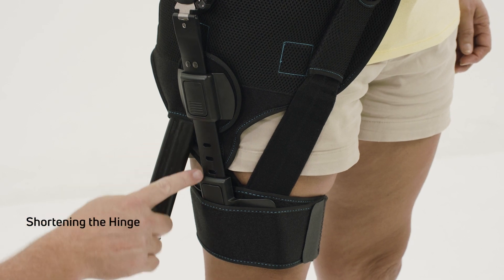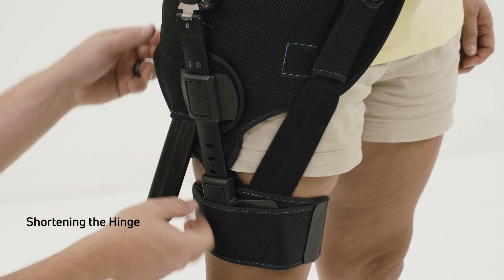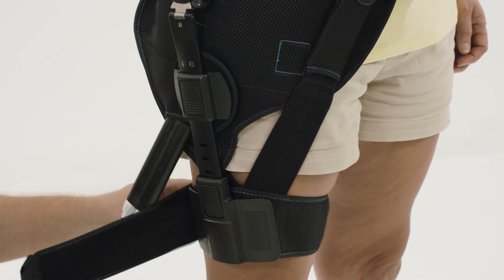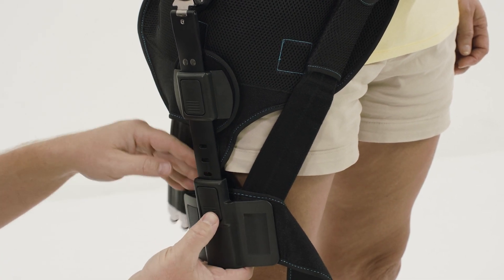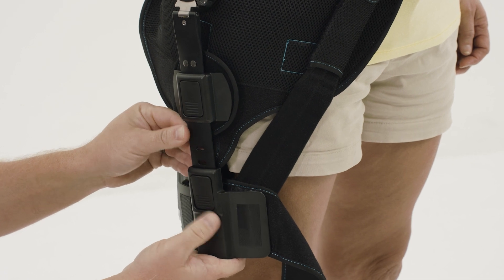The hinge length can be shortened if the patient feels too much resistance when flexing the hip. Simply remove the hinge from the thigh strap and locate the button on the cuff. Depress this button and telescope the cuff inwards to shorten the brace.